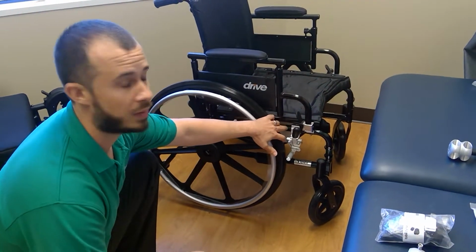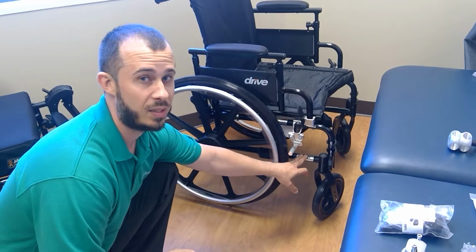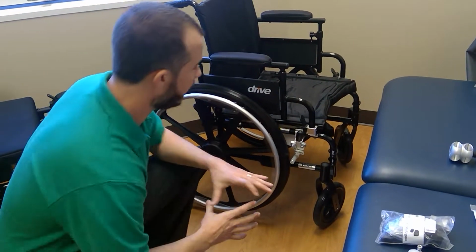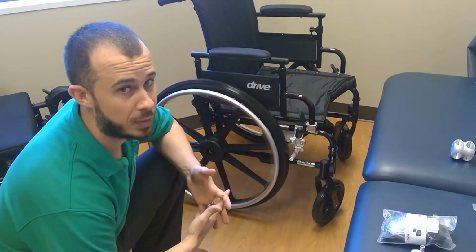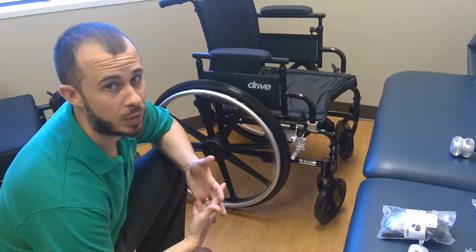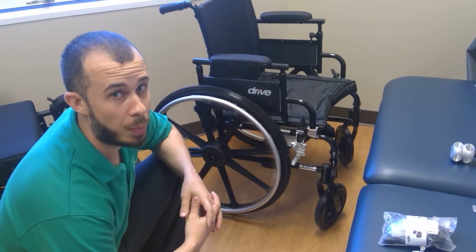On this particular chair, this is a non-tilting chair, so we can choose to mount wherever we find it easiest and most convenient. So with that being said, we want to take a look at what obstructions we have. As we attach a mounting system, we might cause other features of the chair to touch the mounting system or become unusable, and we want to avoid that if at all possible.